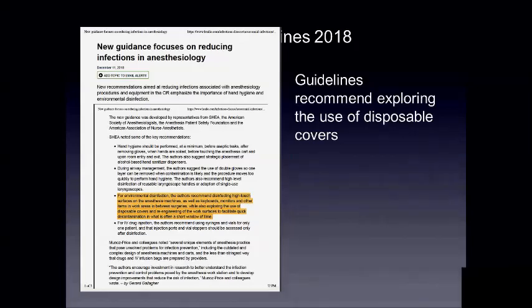So all the problems that we talked about, work surface, equipment, provider, patient, have been shown over and over again to be the cause of cross-contamination. So they came up with this guidance, which summarizes the steps needed to effectively keep the anesthesia end of the patient safer and cleaner, minimizing the risk of cross-contamination and preventing surgical site infection. We talked about both sides of the drape. One side of the drape is all clean and sterilized. The other side is not. This guidance effectively says that, starting from the anesthesia machine, the provider cleaning, and the patient, not using the IV port more than once.